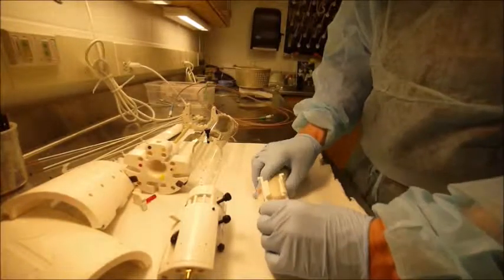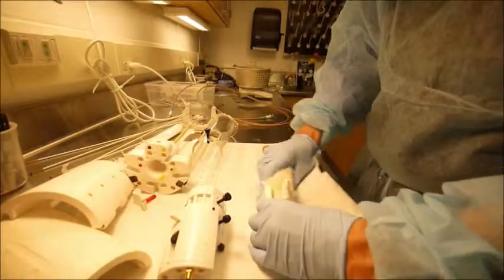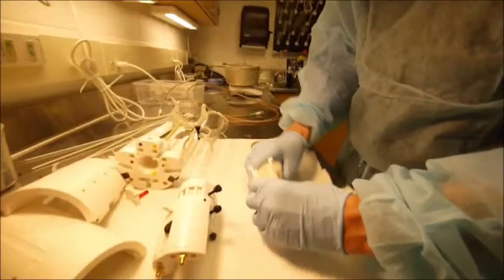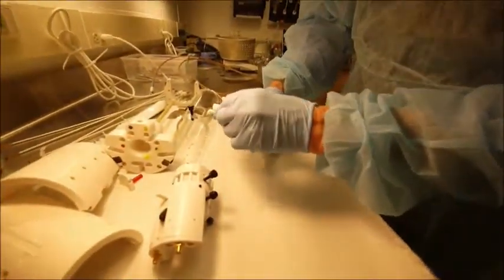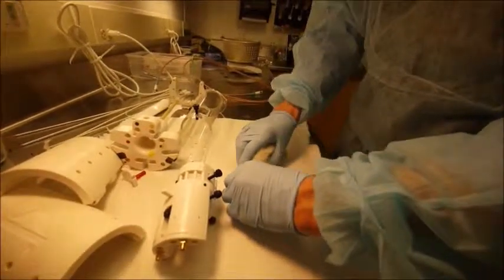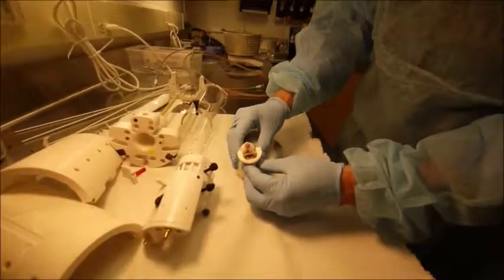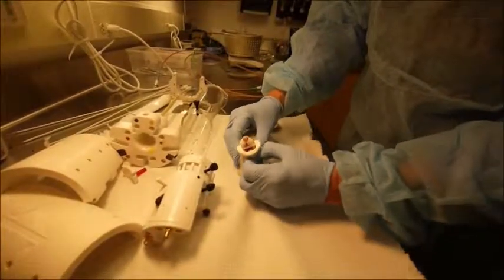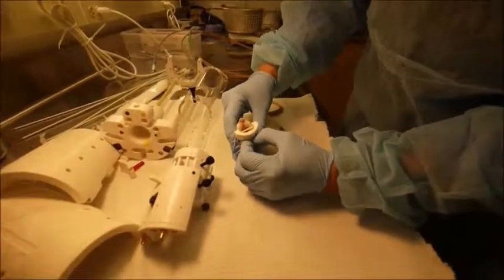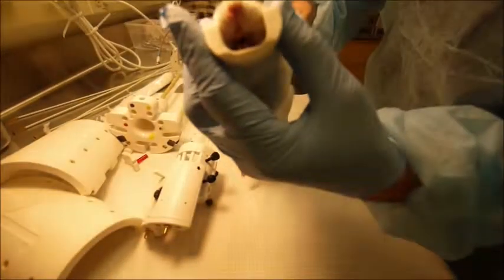Shown is a 400 gram Sprague Dawley rat. Moments before, it was anesthetized with 3-4% isoflurane. The setup takes only 1-2 minutes and should not require additional anesthesia. The rat's top incisors are positioned over the tooth bar in the head strap. The head strap is pushed down over the head, falling into position. The lower teeth must be pulled forward, free of the tooth bar, pinching the skin on the chin and pulled down to free the lower teeth.